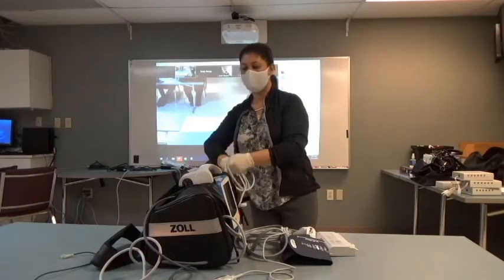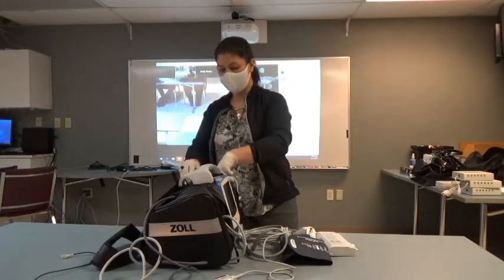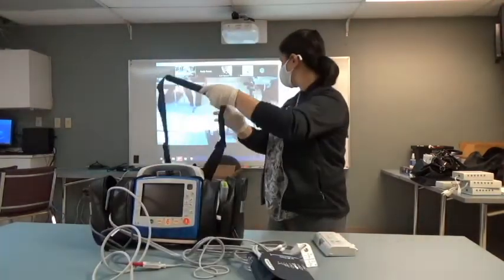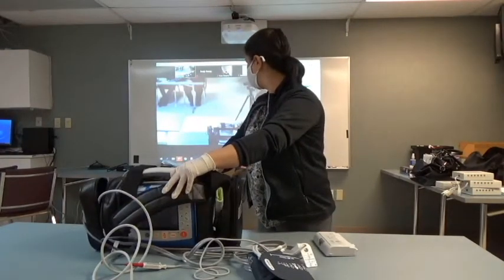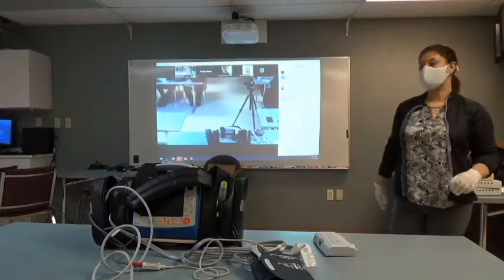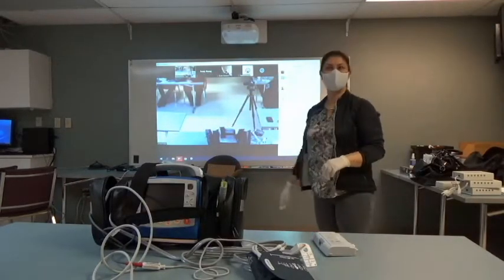Okay. We'll move to the back of your monitor. The back of your monitor has stretcher hooks up at the top. You have a padded shoulder strap. You have a little pigtail back here. This is so you guys can plug into the wall, so that little pigtail sticking up. The wall adapters are all along the sides of the rooms there.